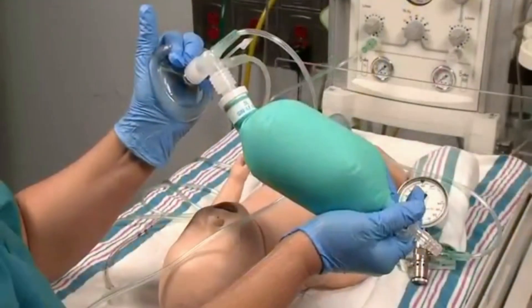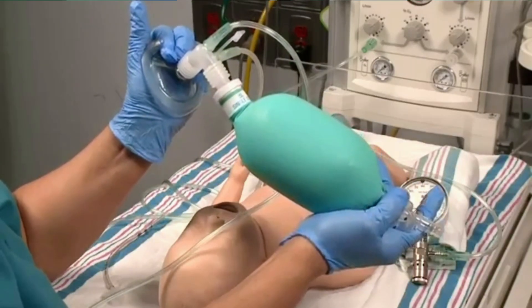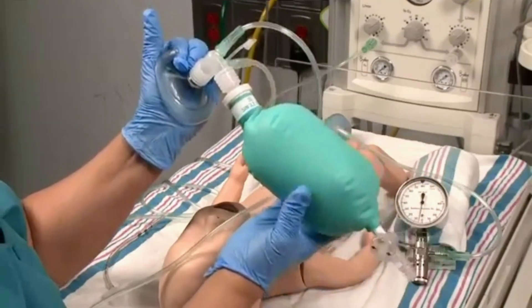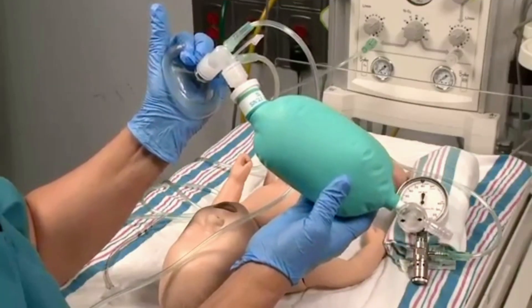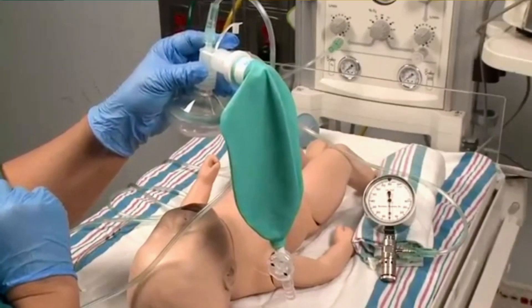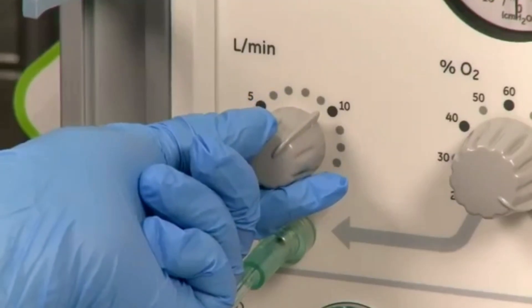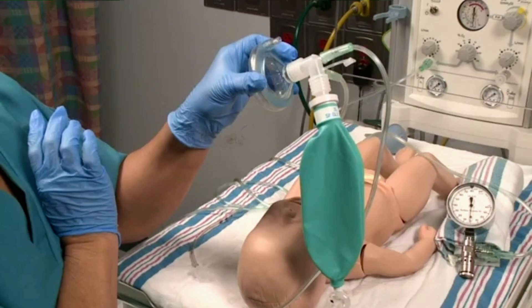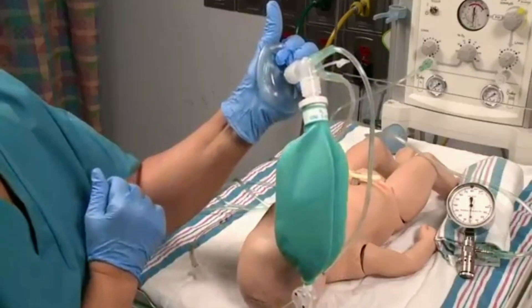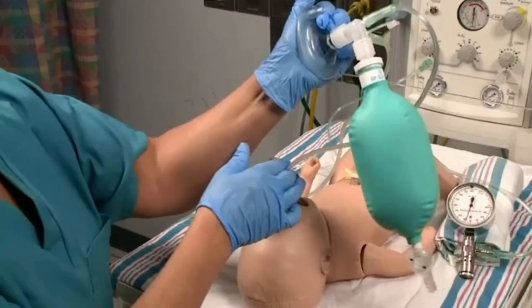The adjustable opening provides an additional outlet for incoming gas and allows excess gas to escape rather than over-inflate the bag or be forced into the patient. A flow inflating bag fills only when gas from a compressed source flows into it — the bag is collapsed like a deflated balloon when not in use. The bag inflates only when a gas source is forced into it and the opening is sealed, as when the mask is placed tightly against the newborn's face or against your palm to check the function of the bag prior to birth.